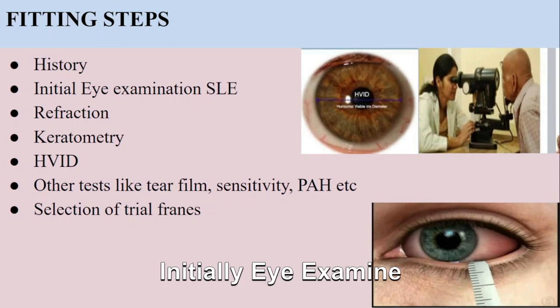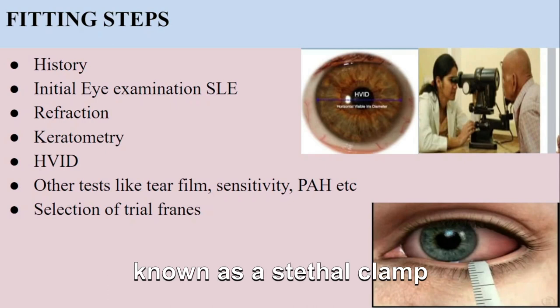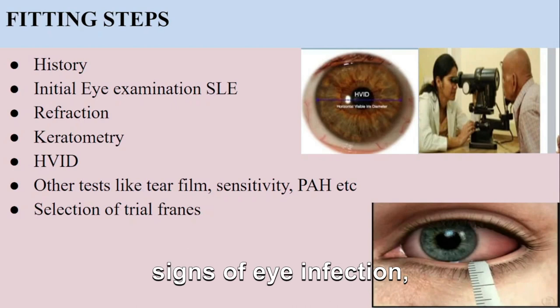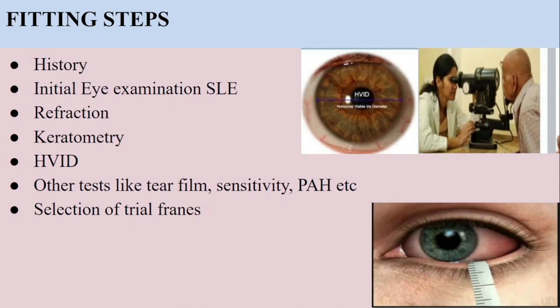Number two, initial eye examination. This examination, also known as a slit lamp examination, involves the use of a special microscope to examine the structure of your eyes. The eye care professional will assess the health of your cornea, conjunctiva, and eyelids, as well as look for any signs of eye infection, dryness, or other conditions that may affect contact lens wear.